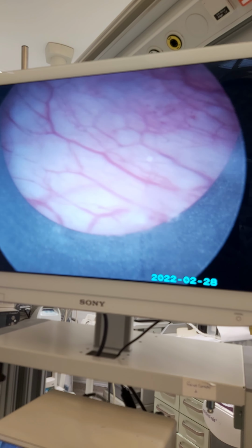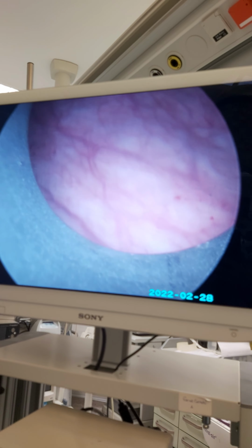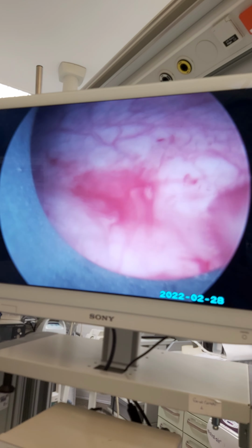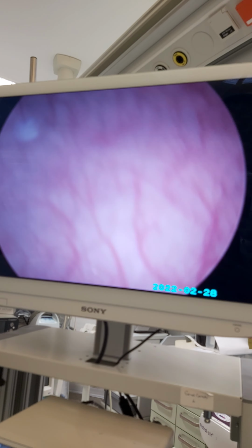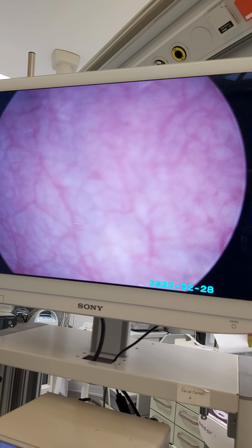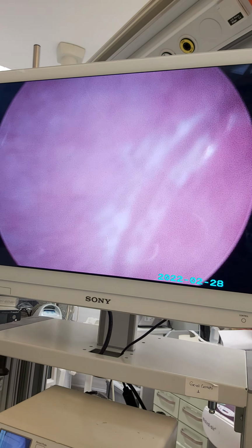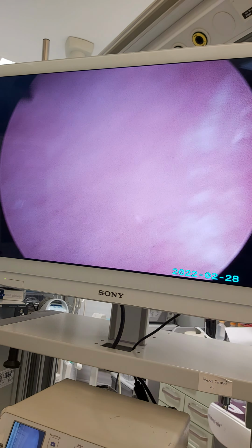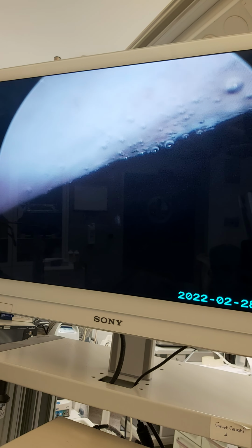We want to wash the bladder, we don't want to leave the infective tissues, embedded infections there. We will wash it a couple of times, but the bladder seems healthy enough. And on the front wall, there were some tissues, we fulgurated these too. Let me show the front wall. We fulgurated these parts of the front wall.